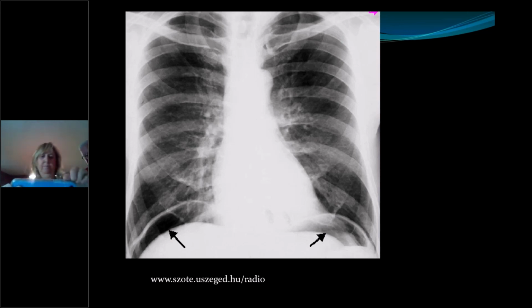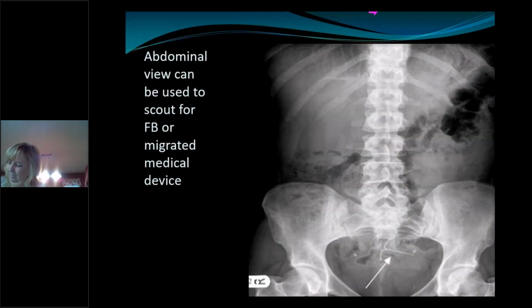So if the person had surgery recently, such as a lap chole or a GYN procedure or a urological procedure, you need to be calling that person and tell them they have a problem. If maybe they have diverticulitis and they had a diverticulum that ruptured, then the general surgeon's got a problem. At the end of the day, somebody other than you or I have a problem here, and it's a surgical problem. So free air under the diaphragm equals surgical consult. That's an easy way to put it.